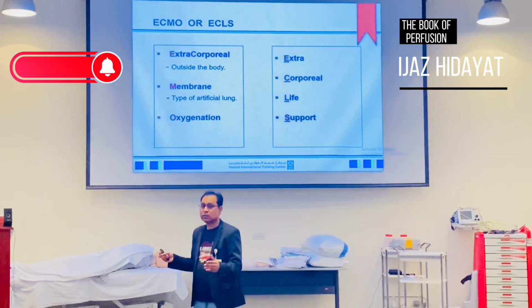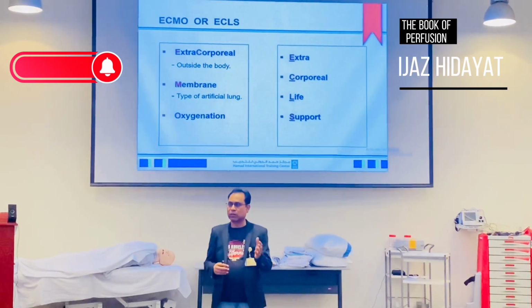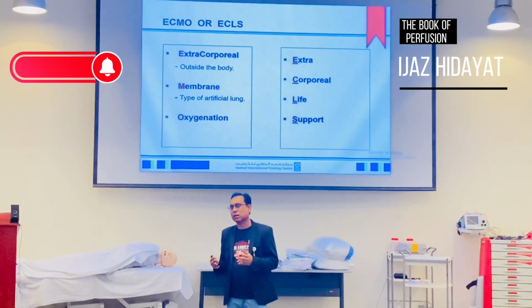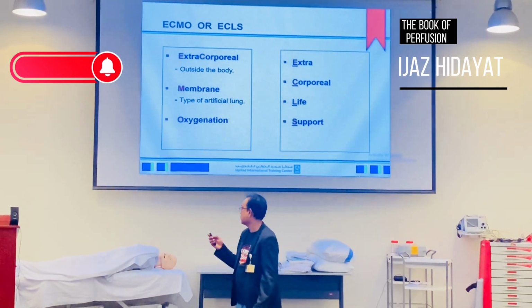The membrane is similar to a lung. It is the artificial lung actually. It is the material which we are going to be discussing in the further slides, which is the man-made lung, which will replace the function of the lungs. So this is the oxygenator.